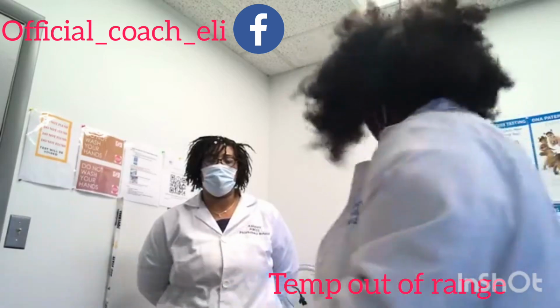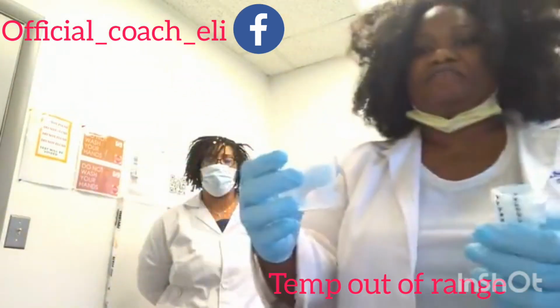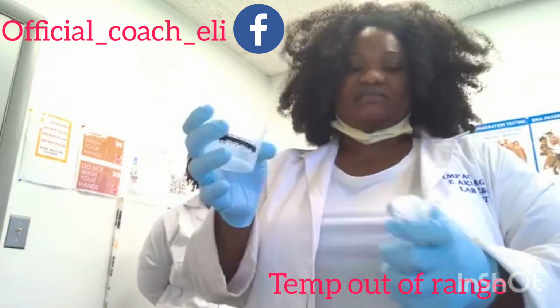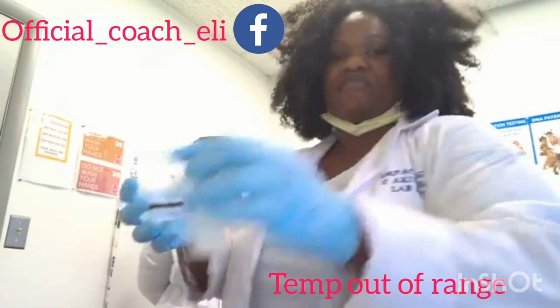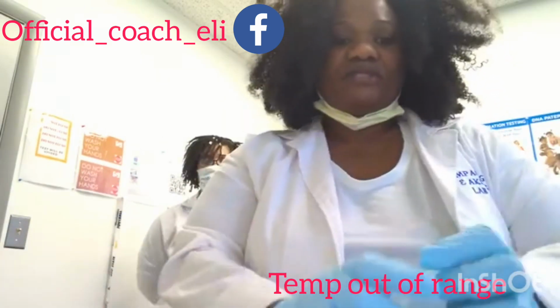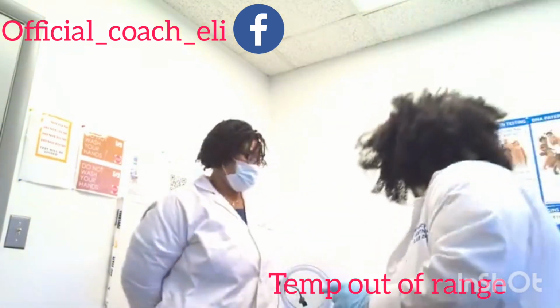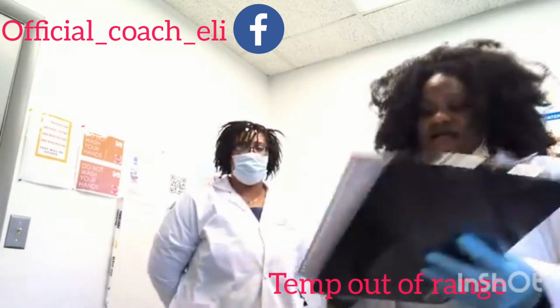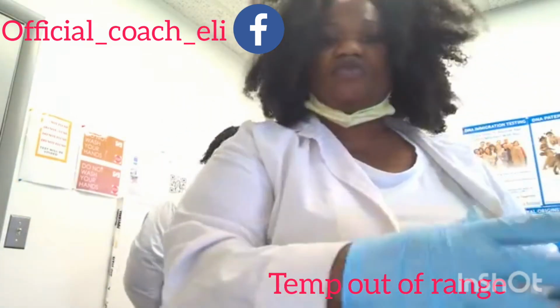So what I'll do, I'm going to do my split collection. So I'm going to pour this batch specimen 30, all right, 15, all right, and I'm going to make sure it's sealed. I'm going to take the first lab copy, the specimen seal, I'm going to take it off and seal it, put it on those 2 bottles.